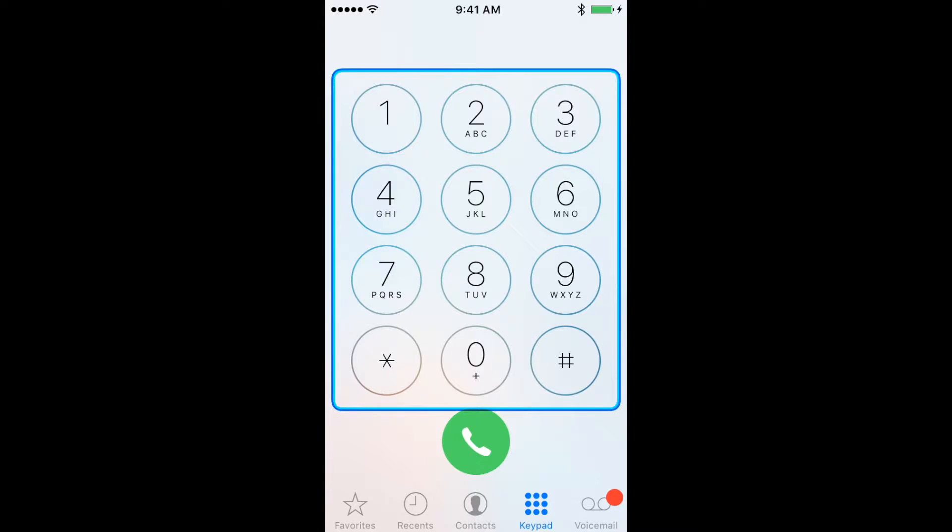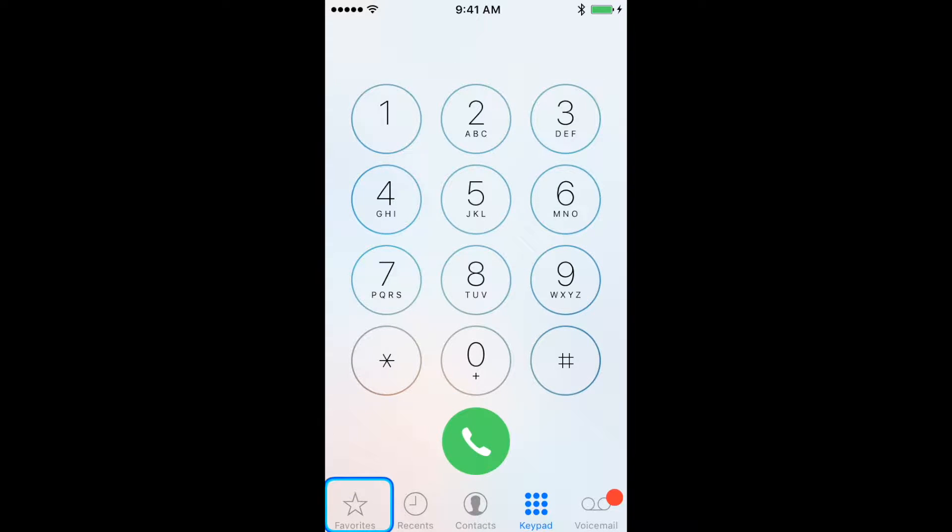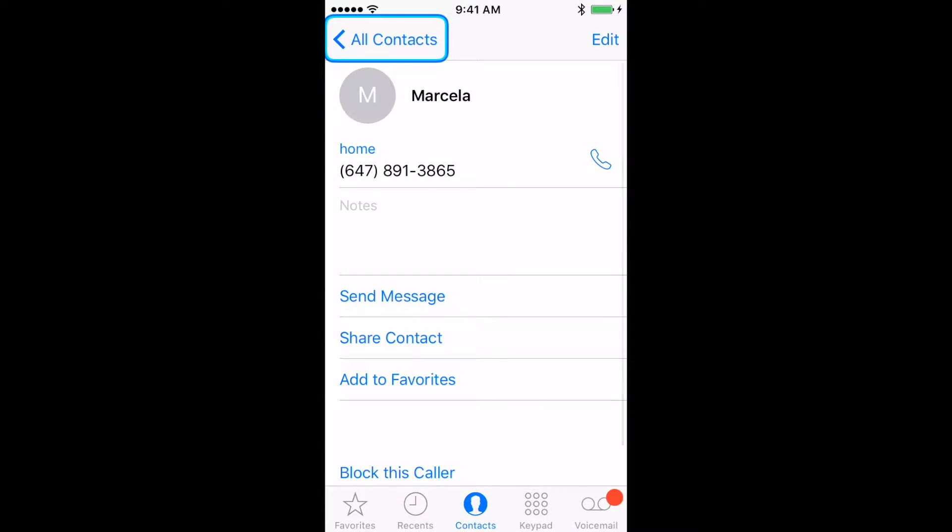If you are looking for a saved contact, wait until the Auto Scanner reaches the bottom of the screen and highlights the contact icon, then press your switch once. On the Contacts page, wait until the Auto Scanner highlights the phone icon next to the desired phone number and press your switch once.